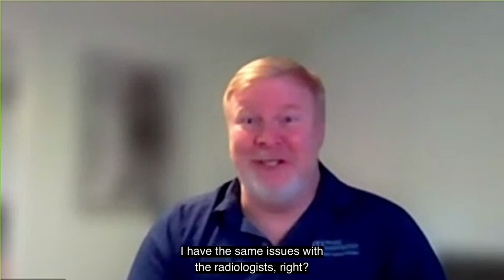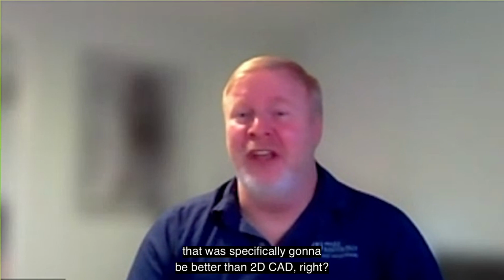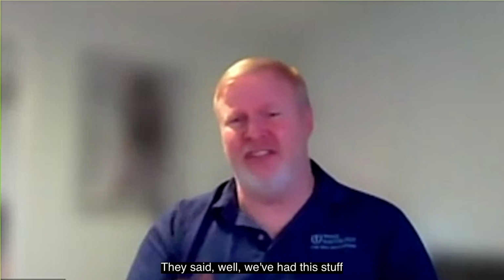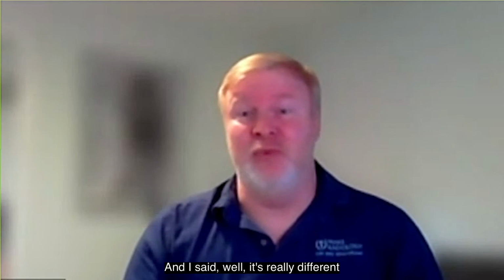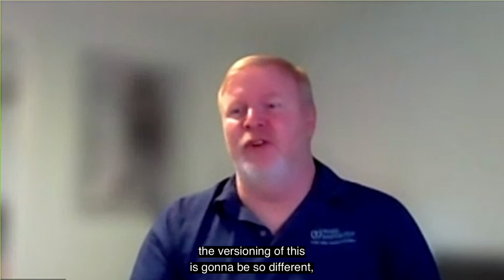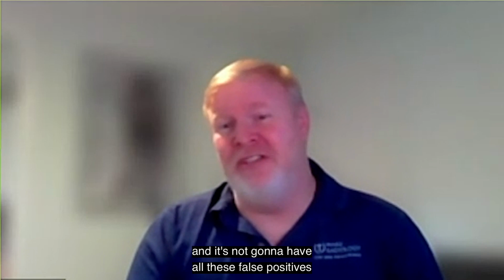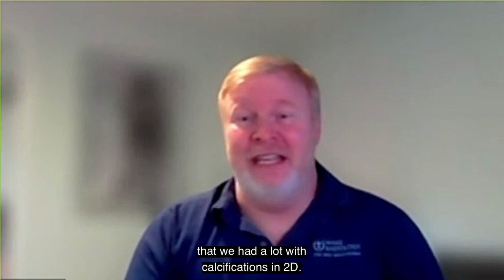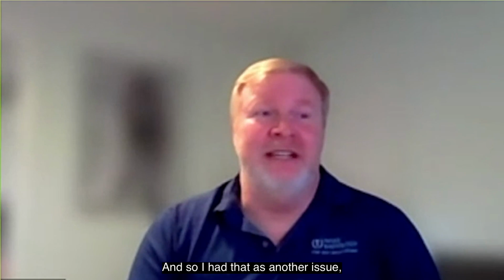I had the same issues with the radiologists, right? I had to convince the radiologist that this would be something that was specifically going to be better than 2D CAD, right? They said, well, we've had this stuff for years and years and years. Why is this different? And I said, well, it's really different because of the amount of data that's been processed. It learns, the versioning of this is going to be so different than what's happening, and it's not going to have all these false positives that we had a lot with calcifications in 2D. And so I had that as another issue.